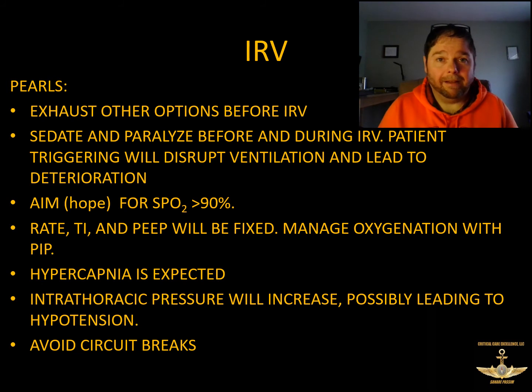That may mean taking the hospital's oxygen tank outside with you until you get loaded up, and that may mean having somebody bring you a fresh tank on the upper pad, or more than one, to get where you're going. So the last thing you want to do at any point in this evolution is run out of oxygen, so make sure you have planned that out well ahead of time.